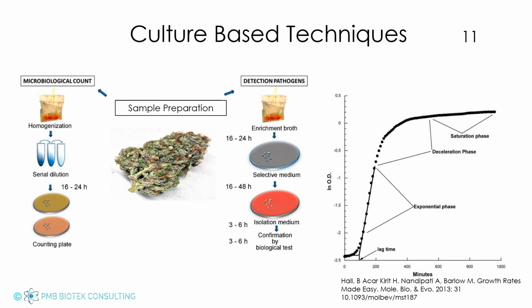Culture-based methods, for the most part, are relatively cheap to run. And if you're trained properly, they're easy to perform, but they're labor intensive. There's a lot of steps that often have to be employed, and they take long. Most micro labs in the cannabis industry are not set up to do culture-based methods because of the requirements for different incubator temperatures and the incubation times that are required, or some of the equipment that is needed for this type of testing. So they're not often utilized.